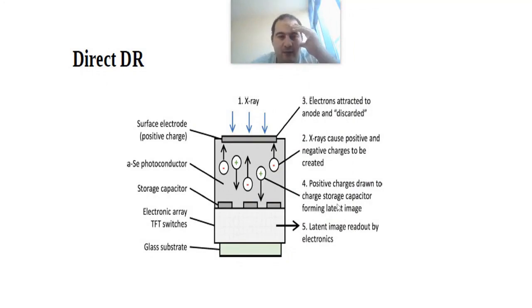as we were explaining. This semiconductor topic is now even present in gamma cameras, even in semiconductor detectors. It gives you more resolved images and addresses many issues in the detection of signals. In the past, they used sodium iodide detectors in gamma cameras, but now they have been replaced with more advanced and efficient detectors.